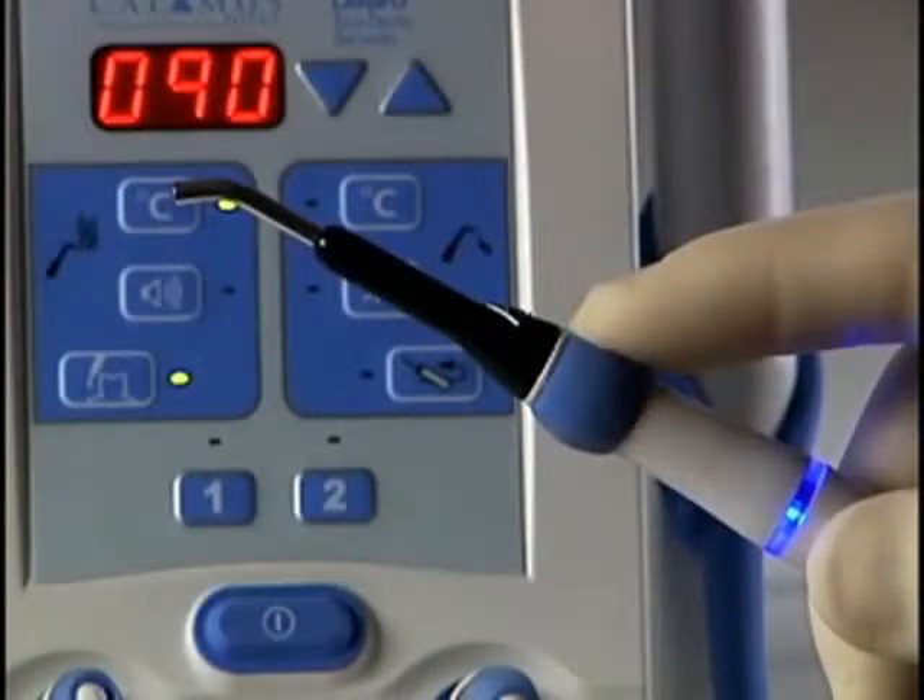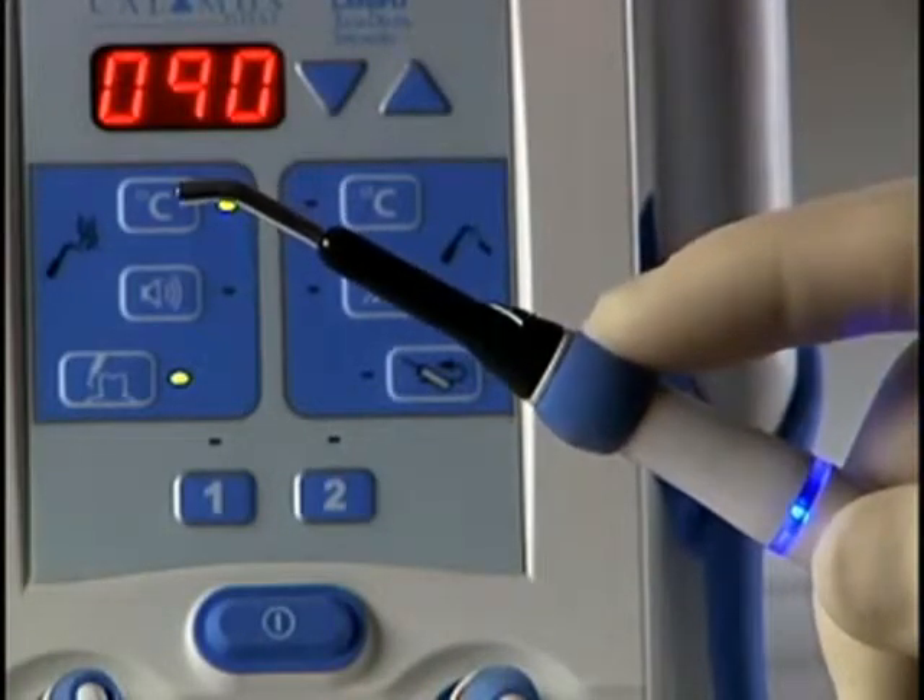To restart after a time out has been reached, release the activation cuff and press again.